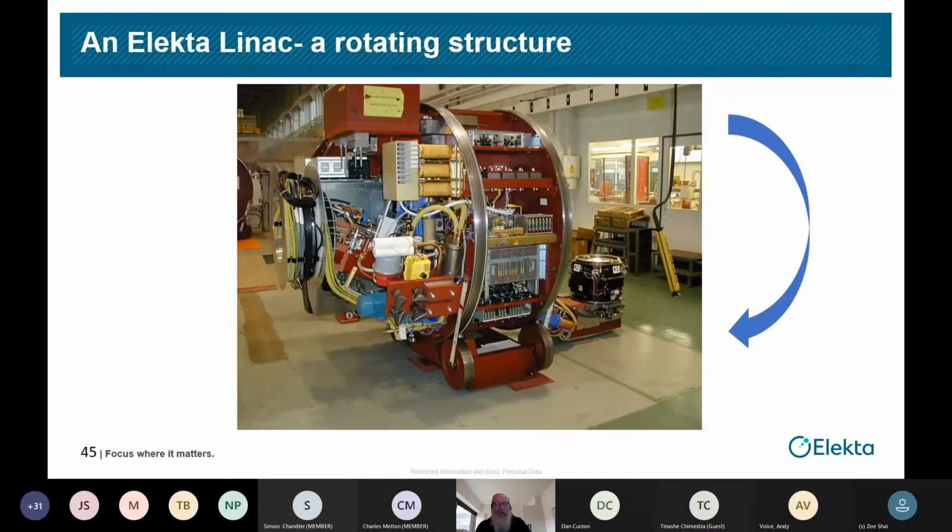The whole thing's about 6.5 tons, and it's all balanced to the center so that it sits on these wheels and can rotate around with really a very small motor. But everything's on there. We've got all of that magnetron microwave generation on there. The accelerator itself is on there, and all the control systems and everything to make it work.